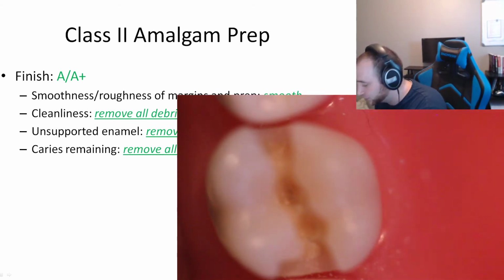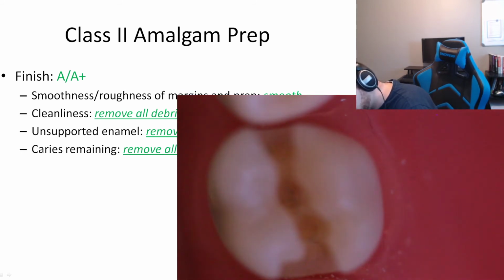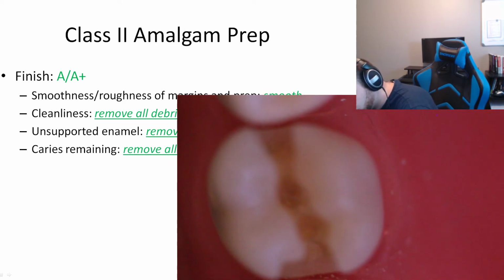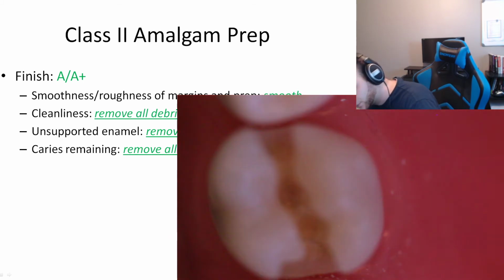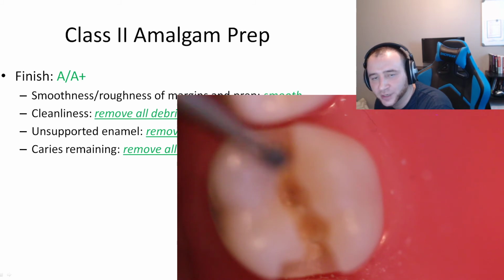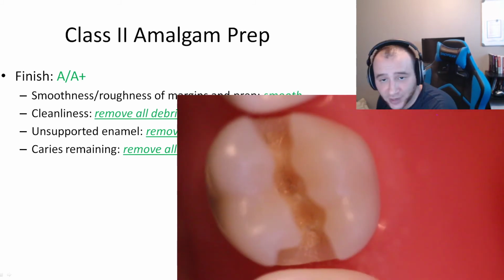Let's go back to caries. That's the technique. Another thing is you could consider using the needle burr if you want, or you could find any other burr. There are so many options that you could become creative and find your own way. But I noticed that these scratches are due to the metal from the slow speed round burr, and it would hit it and there's no water. That's why those are happening. So I noticed that with the high speed that never happens.